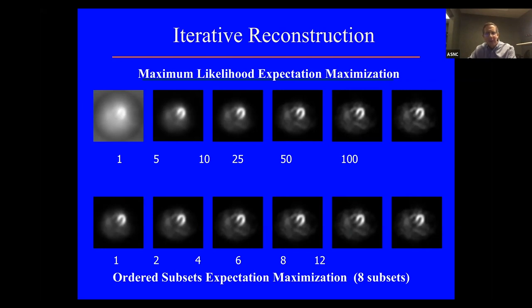And it speaks to how heavily quantitatively intense this is. So it took, in the 1980s, the most powerful Pentagon computers hours to enhance one Polaroid snapshot. It still takes 20 minutes with modern computers. Nuclear medicine studies, we now have it with CT. Now the computer power is increasing further.